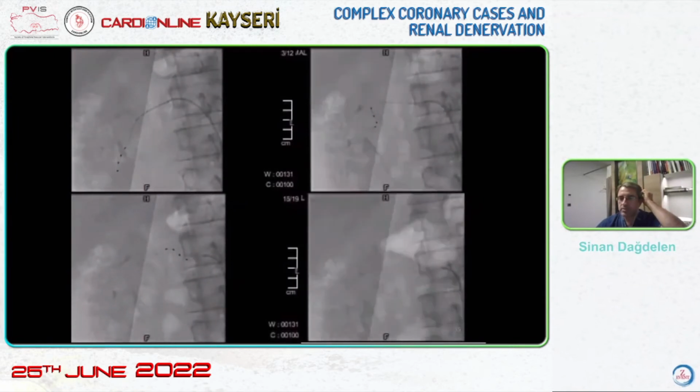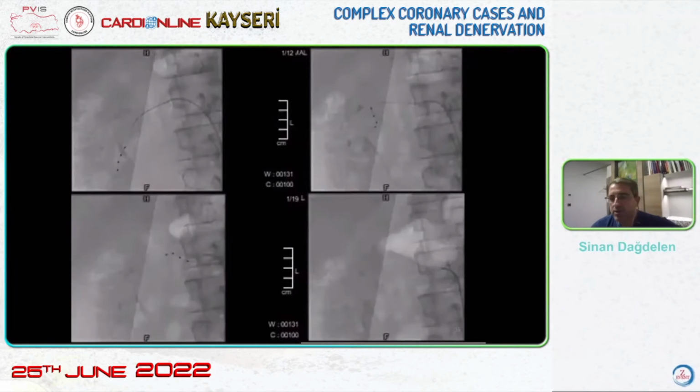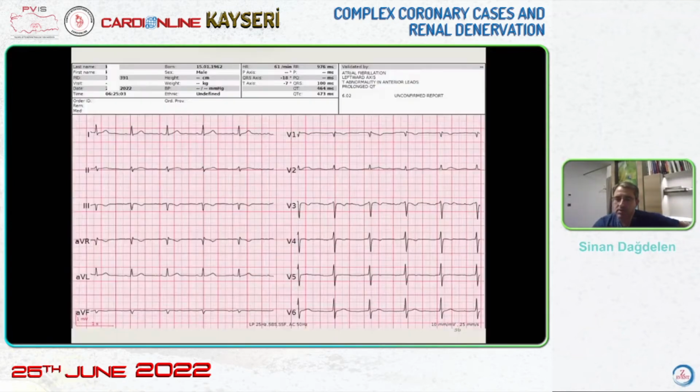And during and after the renal artery work, can we see the success? When we do the ablation for this patient, we always do the control. And if you see any notching or edema on the walls, this is an indirect indicator of the success of the procedure. But of course, to eliminate a spasm, a low dose of nitrate is administered.